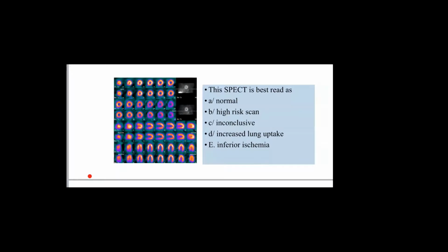If I ask you what this one is called: short axis, right? Yes, short axis. And what is this called? Horizontal.